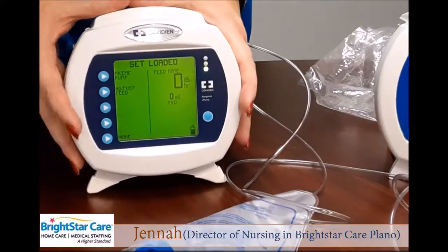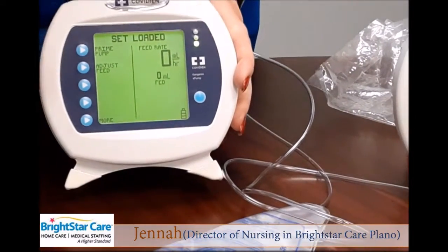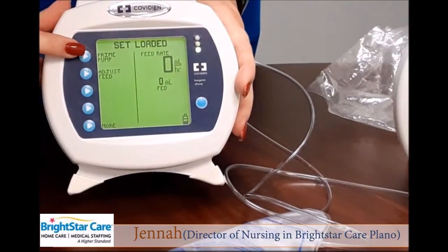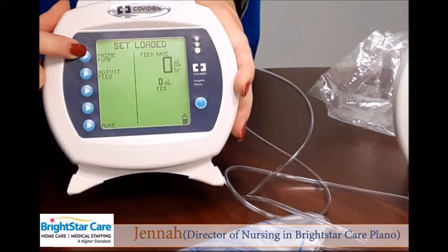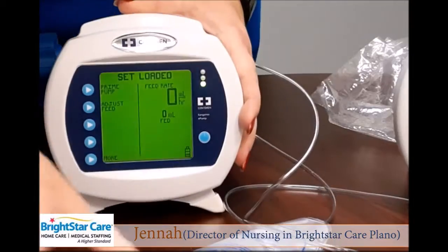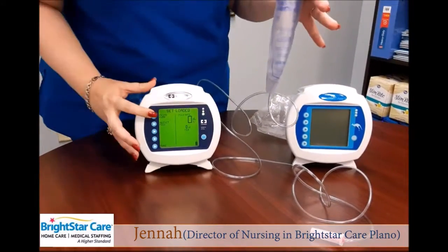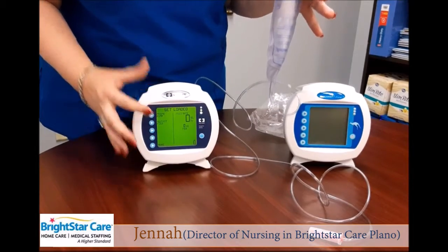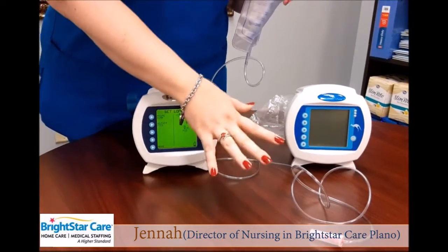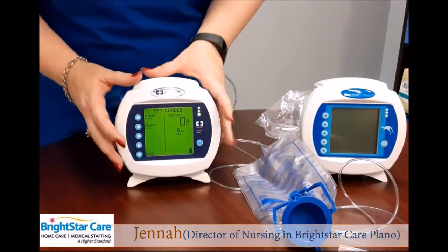At this point, your machine will automatically recognize that a set has been loaded. You now have some options. You can prime your pump, or you can adjust your feed. When your tube feed's filled in your bag, you would go to your prime pump selection, at which point in time you would run your feed through the line. Today I want to talk about how to adjust your rates.